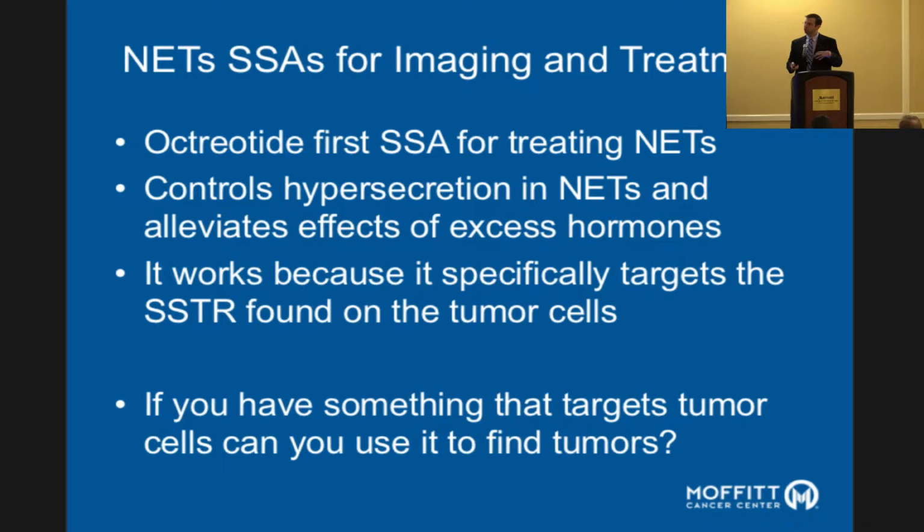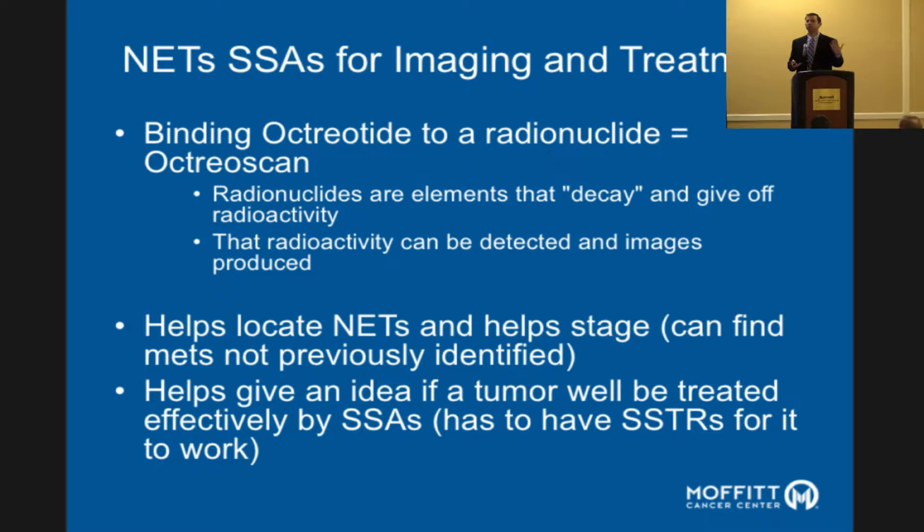And that raises the question, if you have a drug that can target the tumor cells, could you use that targeting of that compound to make pictures of the cells, to diagnose them and stage the patients? And the answer is yes, you can, and that's where the octreoscan came from.